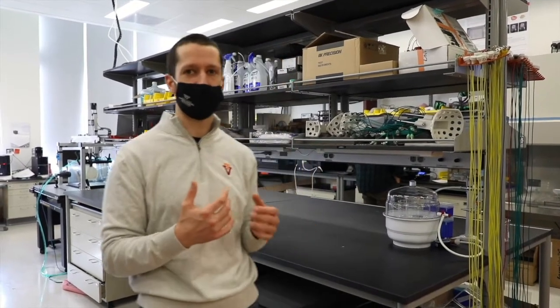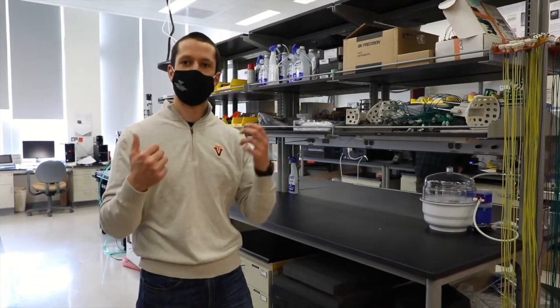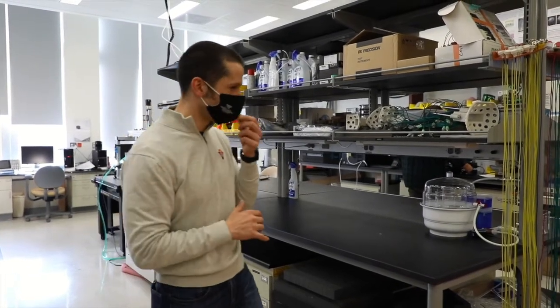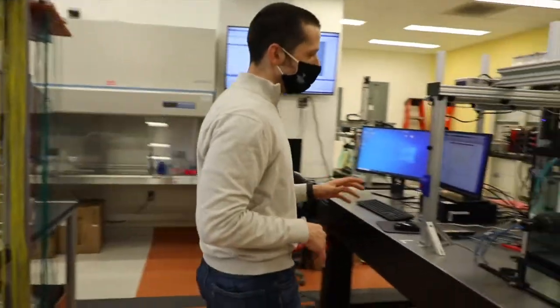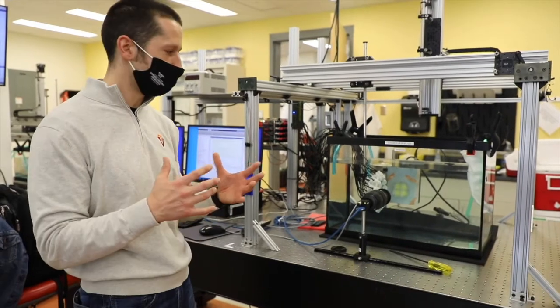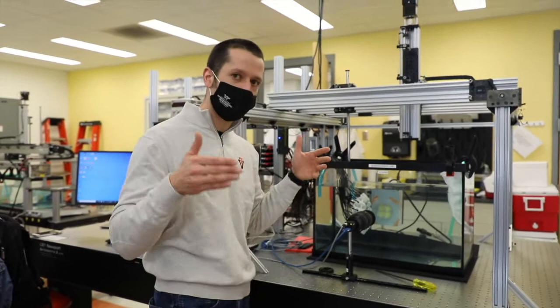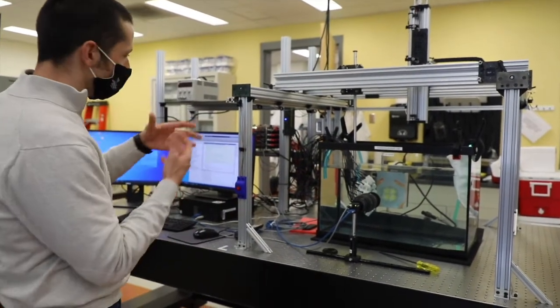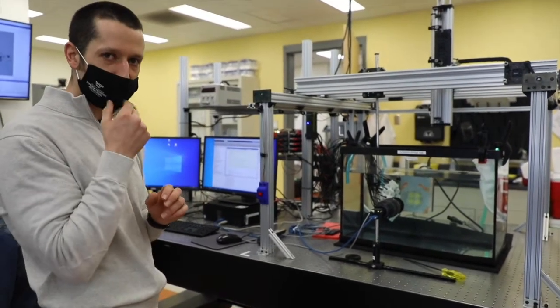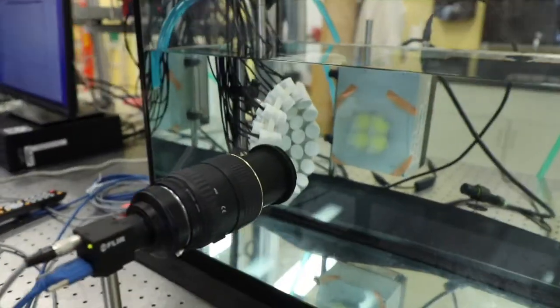Our lab's now developing this for a wide range of other applications, including pancreatic cancer, soft tissue tumors, bone tumors, brain tumors, and on. So the way this works here is if you come around here, you can see this is one of our benchtop setup prototype focused ultrasound transducers that we've developed in the lab. It has individual ultrasound elements focused down to a single point. And then when you actually run the treatment, right at the focal point, we generate these really quick bubbles. And I don't know if you'll be able to hear them on the video, but we can change the rate in a second so you can see it directly.